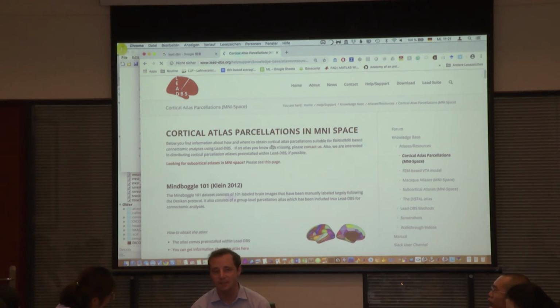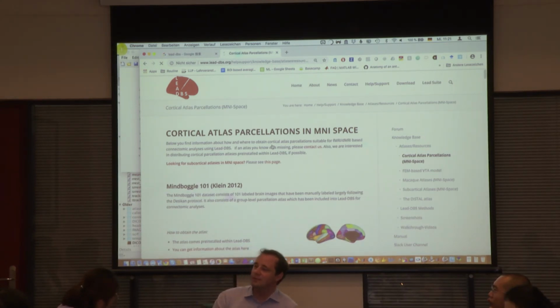Yeah, that's a tough question. I think with tumors, you cannot really use Lead-DBS to do that. Because you would need to use, for example, a normalization scheme manually with ANTs or so. There's good documentation to normalize brains with lesions, to draw a mask and say, don't use that, and so on. But you would need to use custom tools.